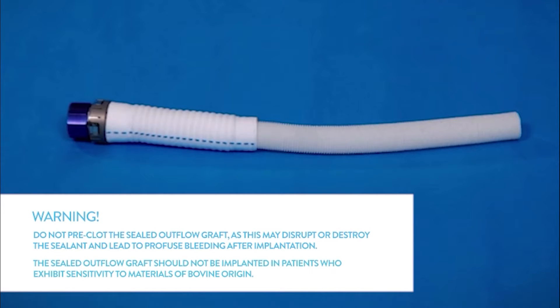Warning: the sealed outflow graft should not be implanted in patients who exhibit sensitivity to materials of bovine origin.